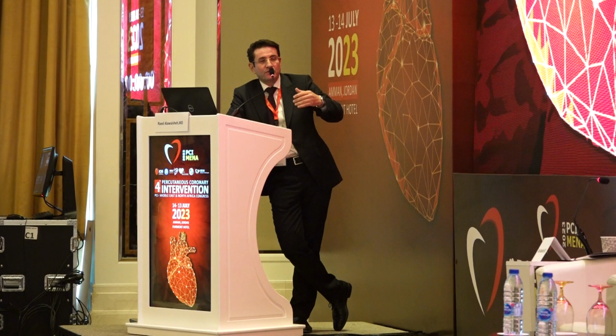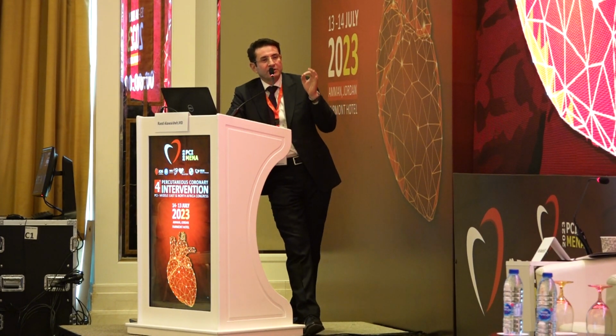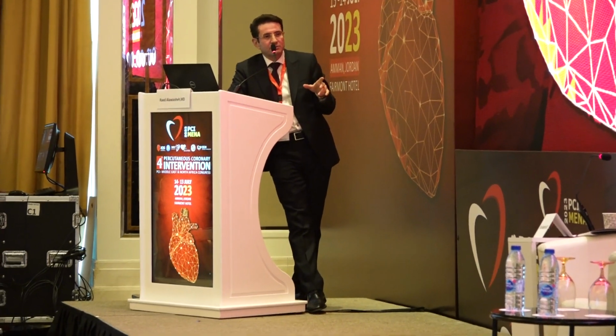And the second point, about the ADR, this is what I'm against with the ADR. If you are able to do ADR without losing the side branches, yes, this is absolutely better. Without losing branches is the ideal situation to use the ADR. But as you know, most of the time with ADR you lose the side branch. Keeping it is really essential. In the second case, you saw how conservative I was to keep the branch there and not to lose it. So the enemy of ADR is losing the branches.